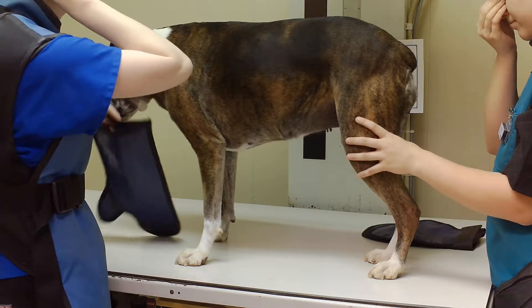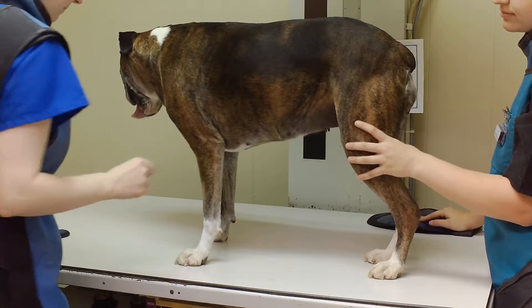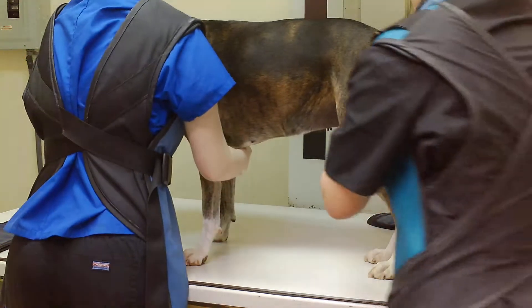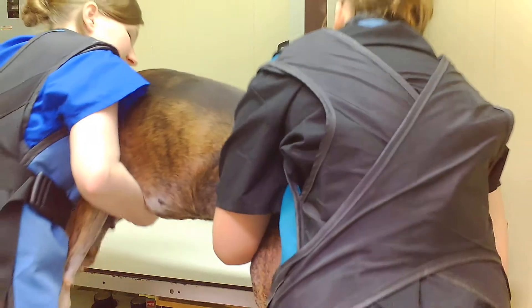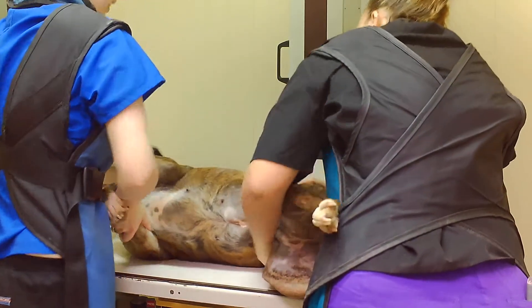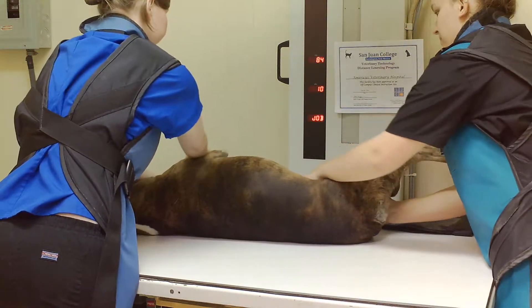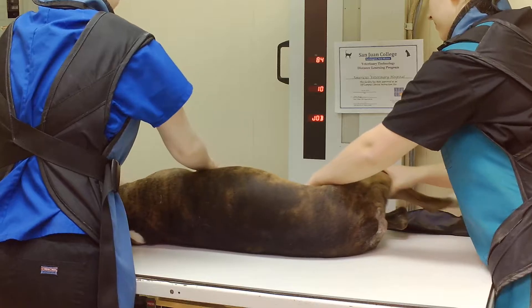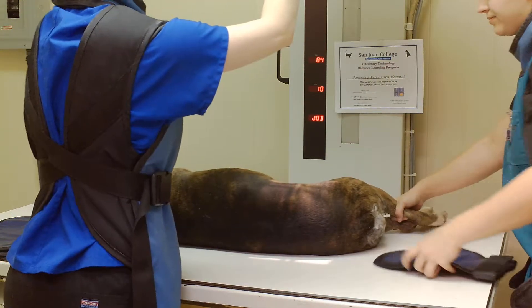We're going to go ahead and get her in left lateral recumbent. Here's the flip — left lateral.